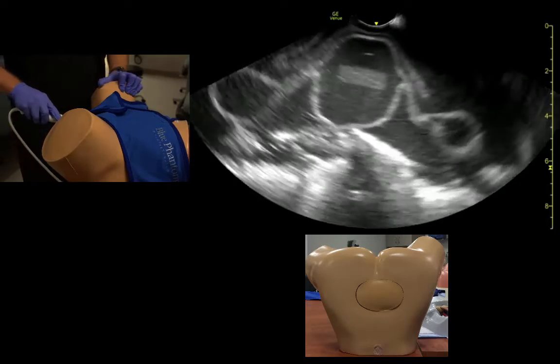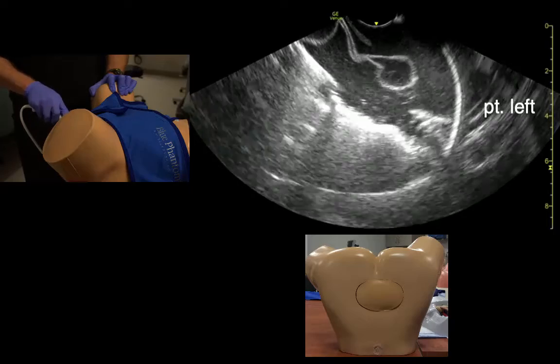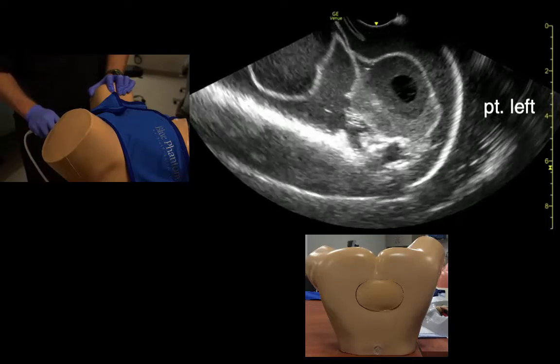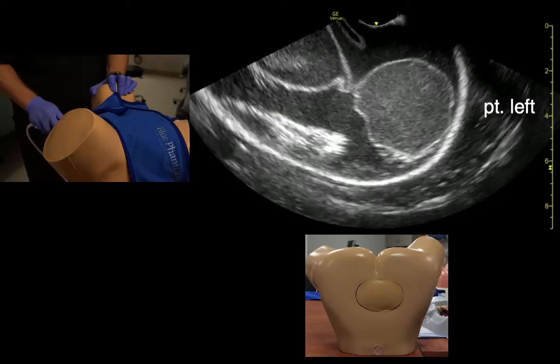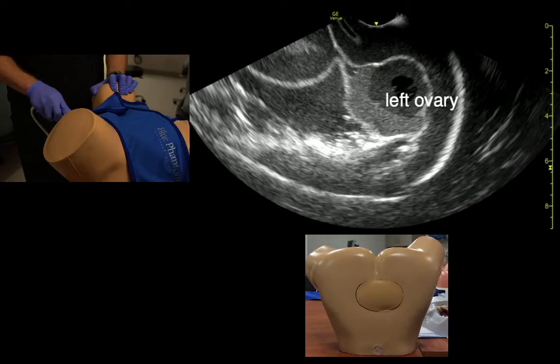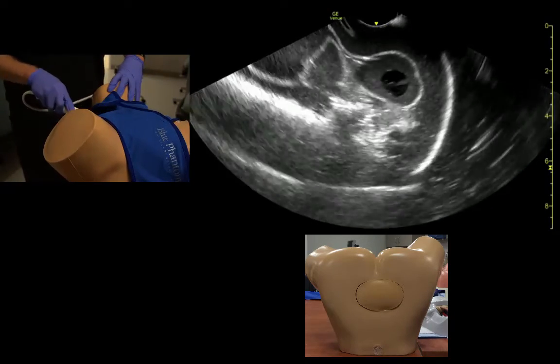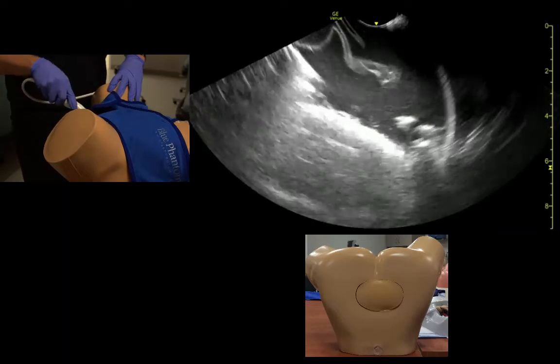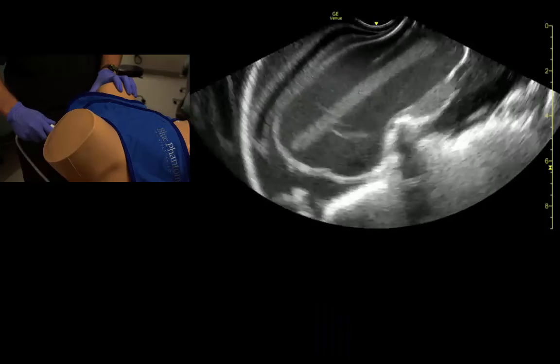Then we back out a little bit, slide to the lateral fornix on the other side, apply some pressure again, and fan all the way through from ceiling to floor until the ovary disappears in each plane. Again, if we need to stop and apply color or do Doppler measurements, we could do that. And that's pretty much the exam.